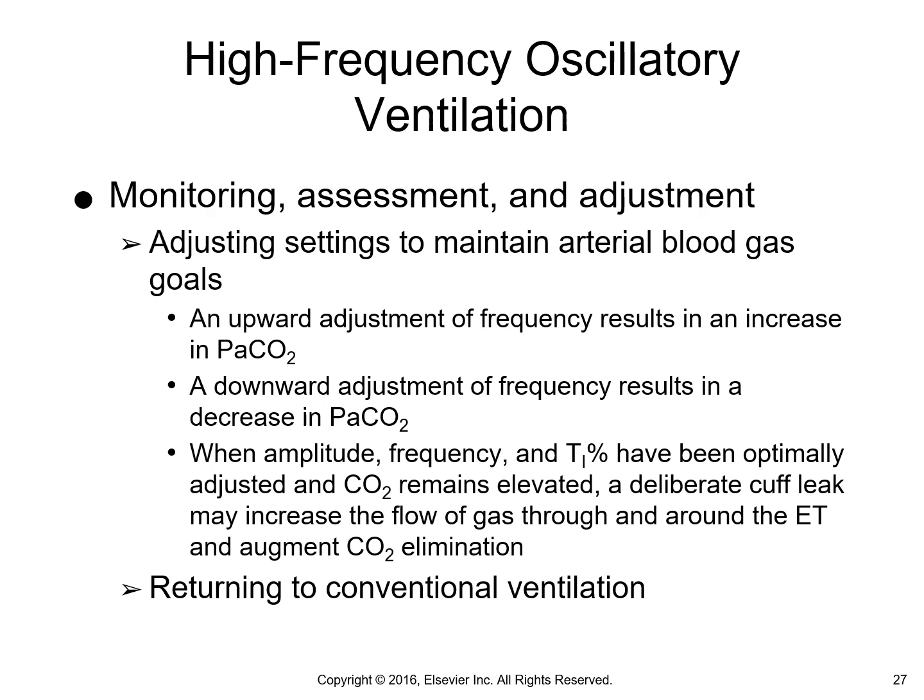Okay, so we start looking at when do we think it's time to return our patient to conventional ventilation. So once this patient is stable with a mean airway pressure of about 20 to 24, your SATs about 88% or more, hopefully a little bit higher to give you a little more leeway, and FiO2 is less than 50%, you can think about switching your patient back to conventional ventilation.